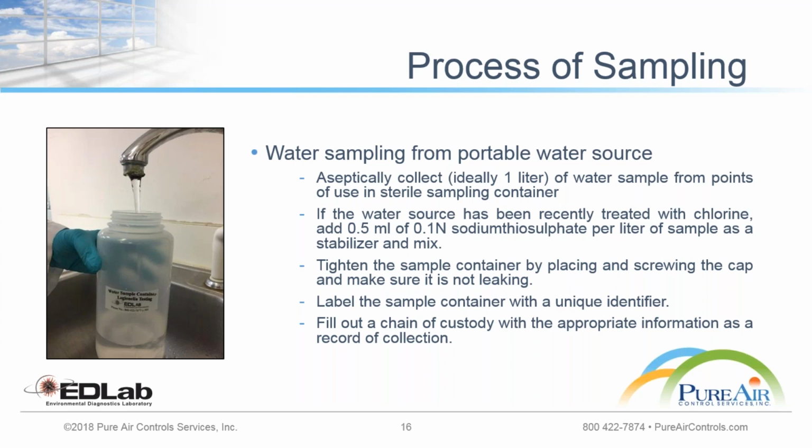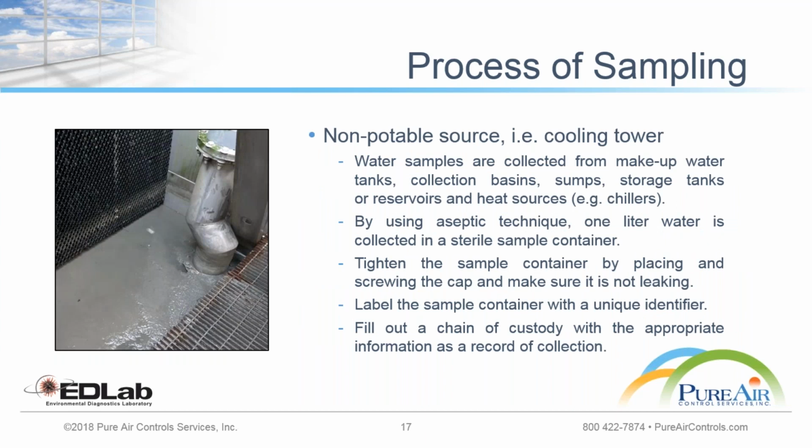Now, if you are collecting the sample from a non-potable water source, such as a cooling tower, etc., then you have to use the same method, but you should be collecting the water either from the makeup water tank or from the sump. Try to avoid a lot of debris and things like that, but you should again be drawing the sample from the water source, as I said, and then you use the same method and you send it to the laboratory.